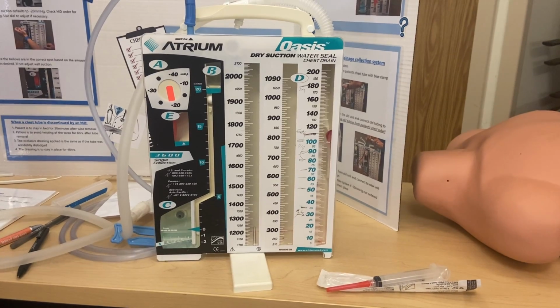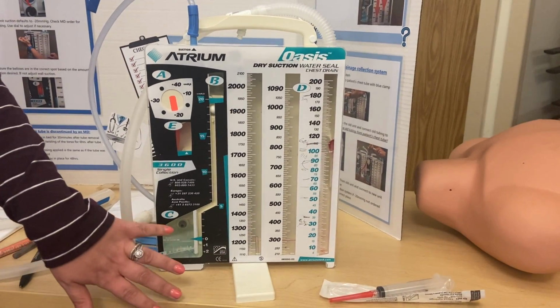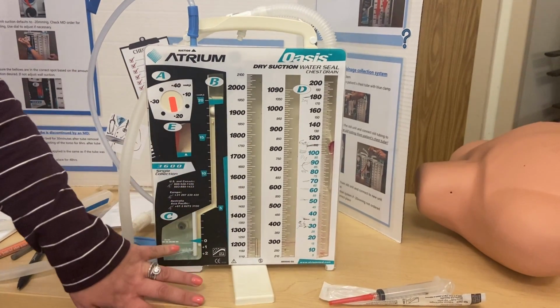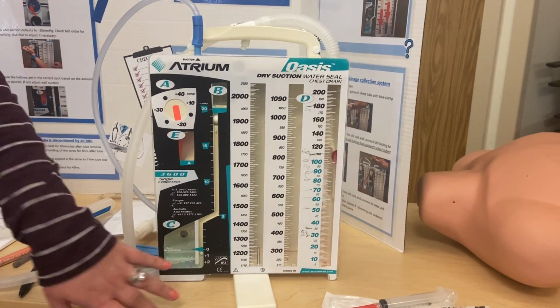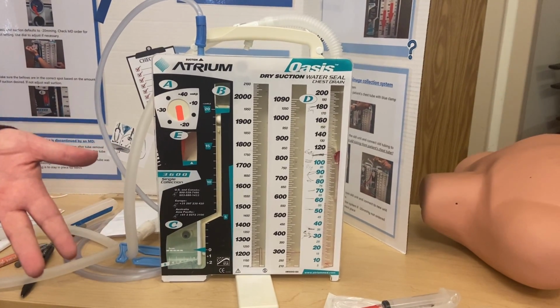Sometimes they do expect a little bit of an air leak, especially if you have a pneumothorax. The thing is that air, if you have a pneumo, is going to go right into this water and you'll see an occasional bubble. That's different than consistent bubbling, which indicates an air leak. But just keep the provider informed. They may be concerned, they may not be concerned.